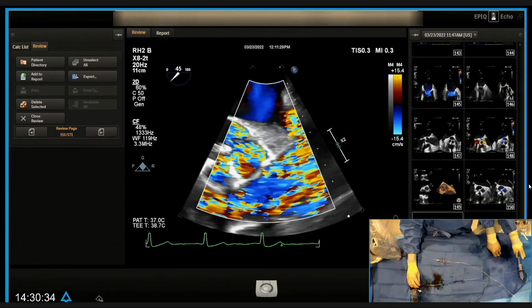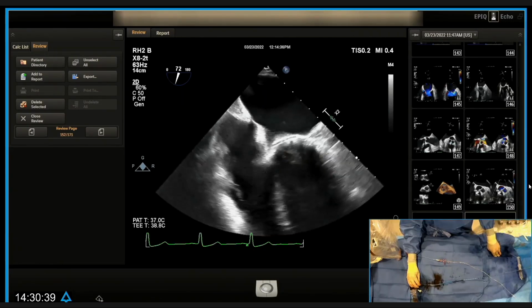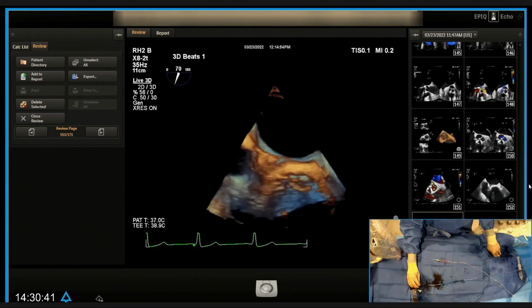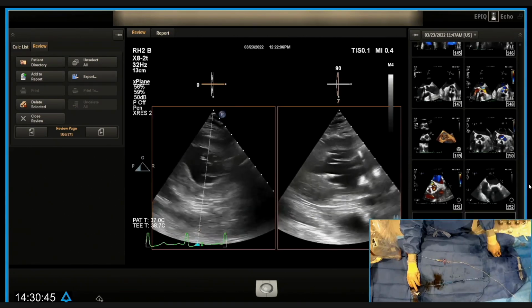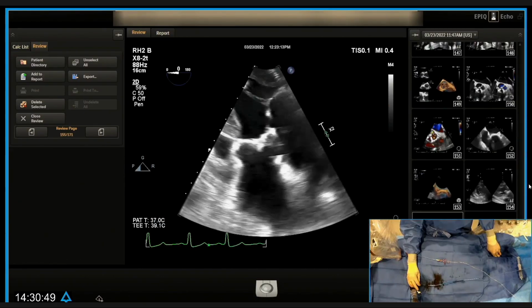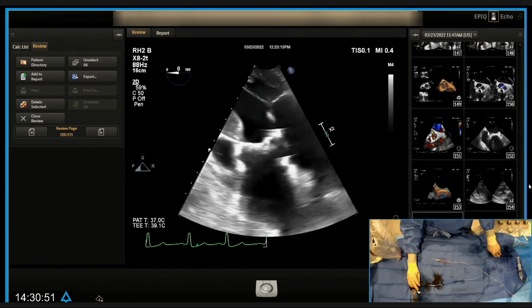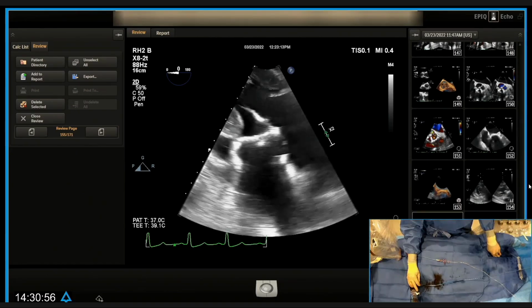That's obviously the LAD. There is no circ. We did find it later on, and you can see here a calcified circ coming around, both on 2D and on three-dimensional imaging. LV function remained quite normal, but it is a markedly thickened valve and ventricle, so likely to have abnormal strain imaging, which may account for some of our hemodynamic findings.